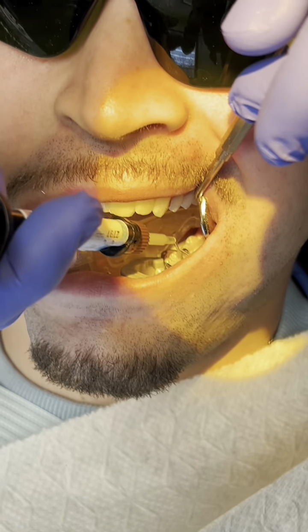With a dual cure property — what we call a directed shrinkage polymerization process — we'll get directed shrinkage towards the most heavily bonded walls. And within those bonded walls, we'll get what's called a complete seal. The ultimate goal in resin-based dentistry is a complete seal.